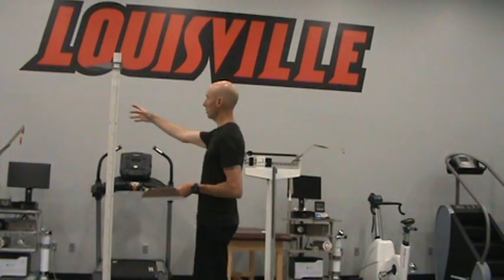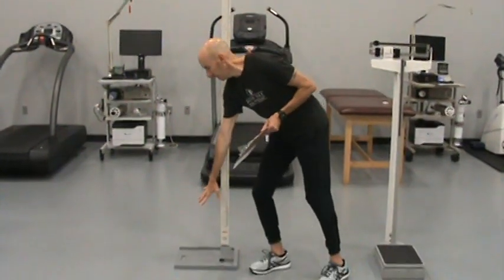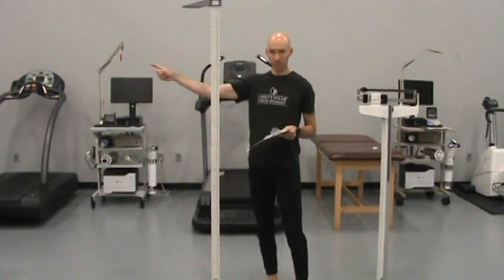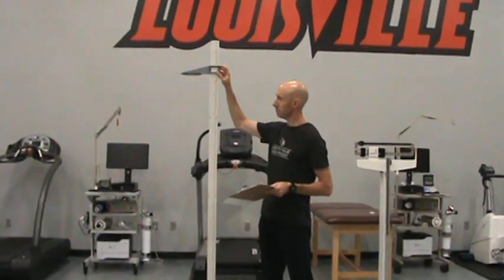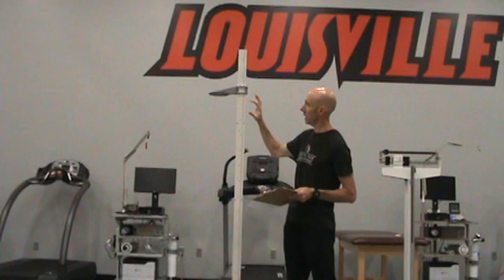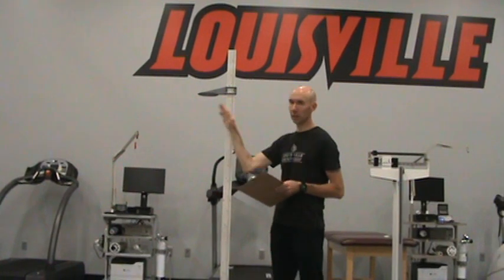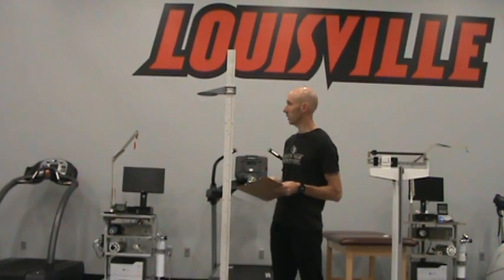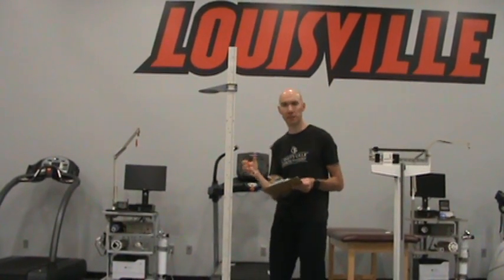First I want to introduce some of the tools. This is referred to as a stadiometer. The process for using this would have the subject remove their shoes and stand directly on the platform facing away from the device. Then we would slowly move the plank down, noting where the two black arrows intersect on the measurement tool. We have inches on the left and centimeters on the right. We will record both for the lab assignment because we will use the different units in different calculations.